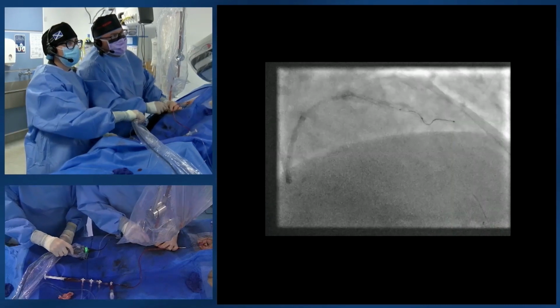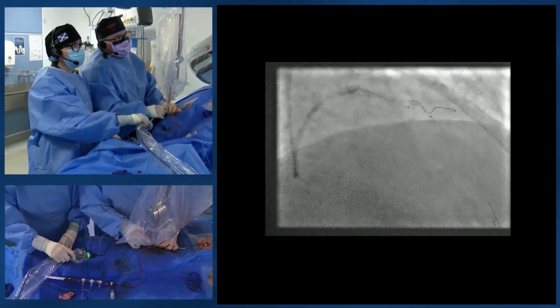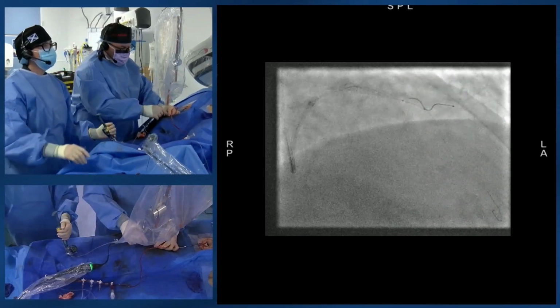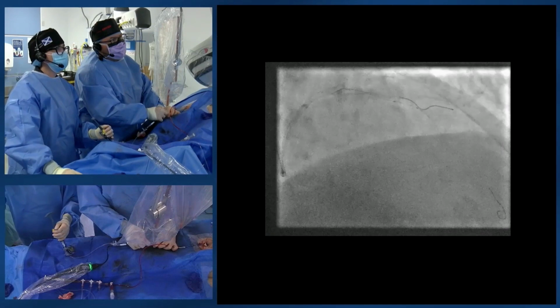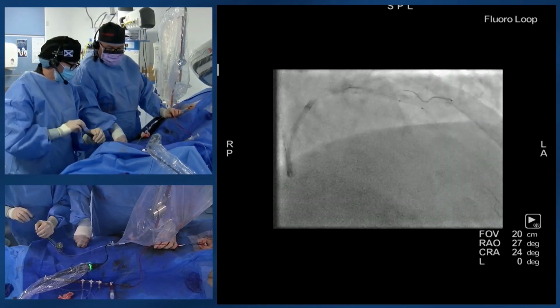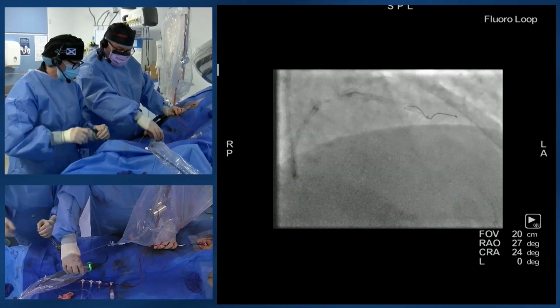I don't think we really need to go much further than that, do we? I think we just save. As I say, we've only got 80 pulses. They come in bursts of 10. Save the therapy. Okay, so we give 10 there and see how we feel, and then we can creep our way back. Yep. Okay, so what I'm going to do here is go up to 4 atmospheres. Stuart's going to fluoro check the balloon's up.